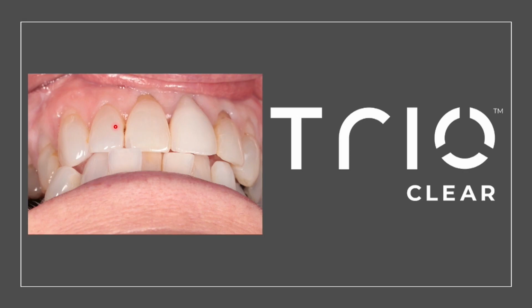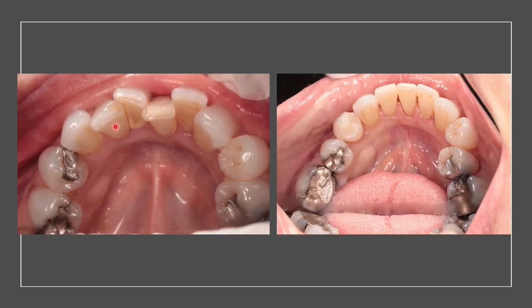So to show you the finished case here, you can see this did involve removal of an incisor in order to give us a better arch form and create space to bring back that tooth in crossbite. Nice arch form at the end of that.